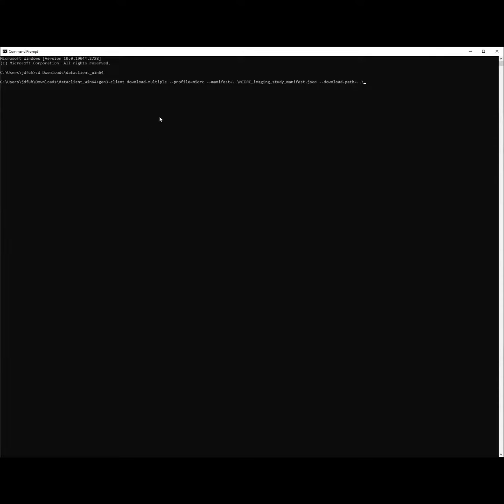Then use this command listed here to provide the location of the file manifest which you just downloaded, which I have called MIDRC Imaging Study Manifest, and the location to which you would like to download data.